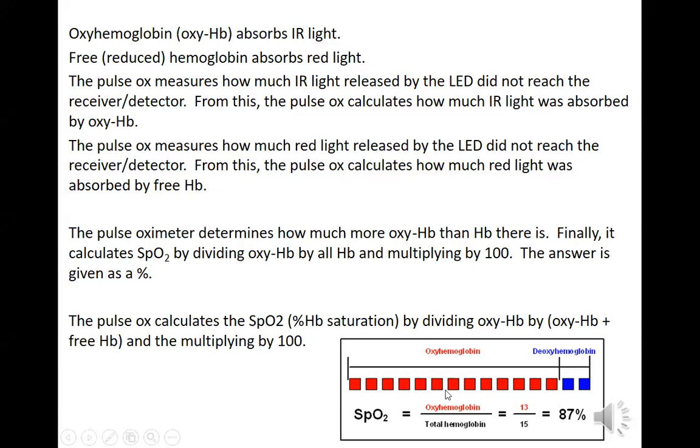Okay, so it's the same thing though. It's the amount of hemoglobin you have and the amount of oxyhemoglobin in that total hemoglobin. And that's all the SpO2 is. That's all the pulse oximeter is showing you. It's not telling you how much hemoglobin is in there if you're anemic, right? It's not telling you the absolute amount, like CaO2, which is going to take into account the total hemoglobin, the saturation of oxygen on hemoglobin, the solubility of oxygen in the plasma, and also the partial pressure of oxygen in the blood.